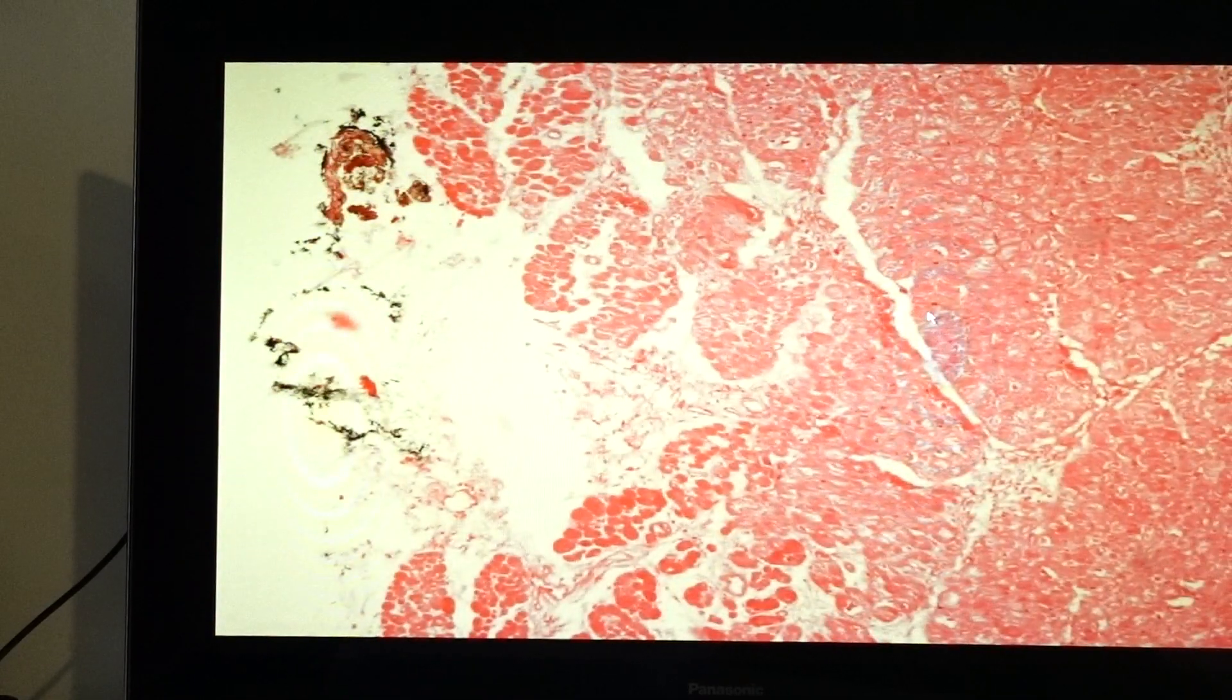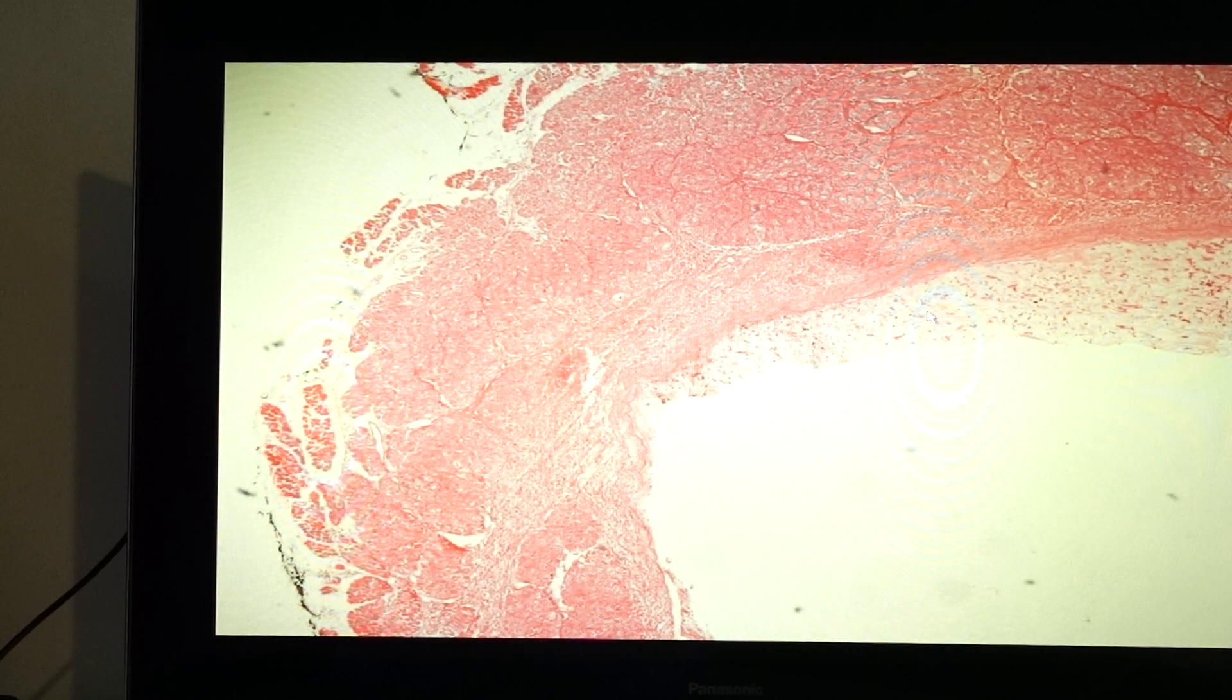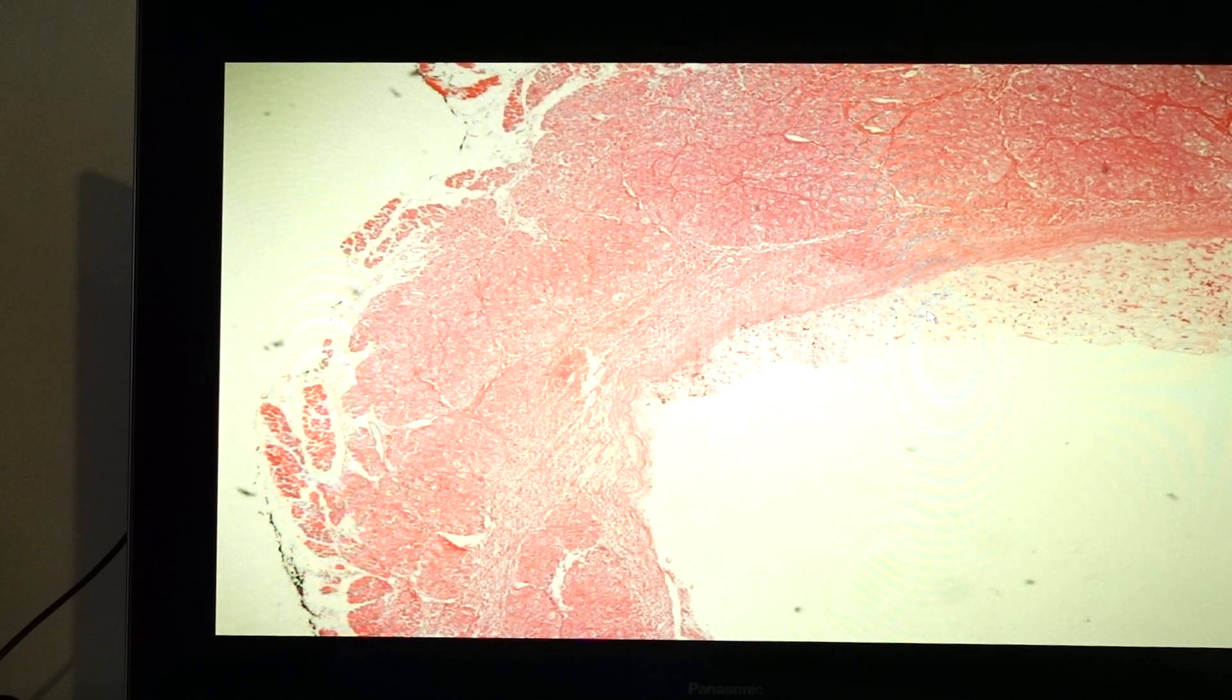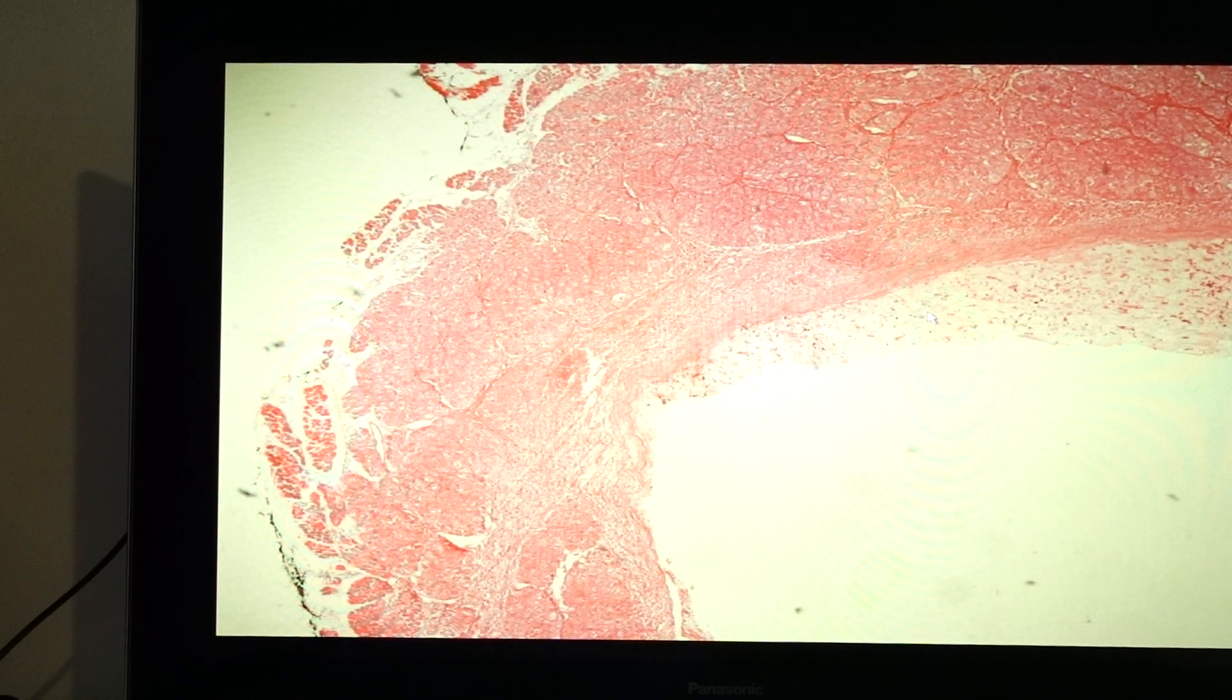Next, we have slide 166. This is cardiac myxoma. This is a tumor that would be the most common primary tumor of the adult heart because in children, it's the rhabdomyoma. For sporadic cases of cardiac myxoma, there are no mutations identified, but for familial cases, it's associated with GNAS1 mutation if it's associated with the McCune-Albright syndrome.